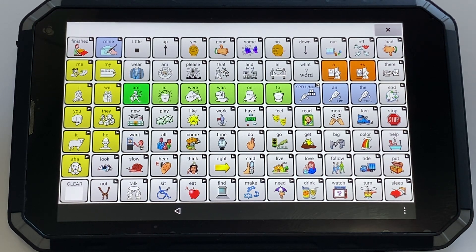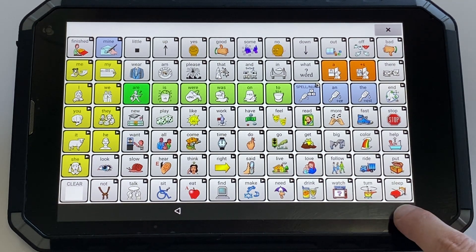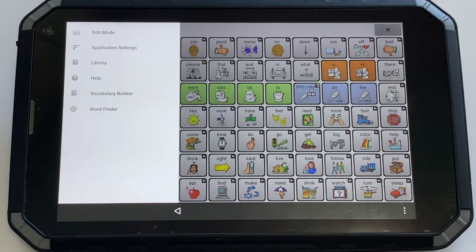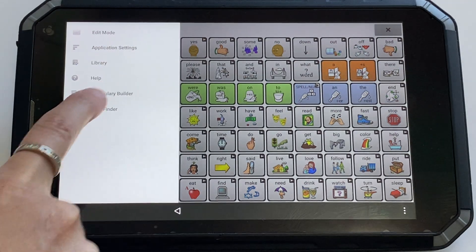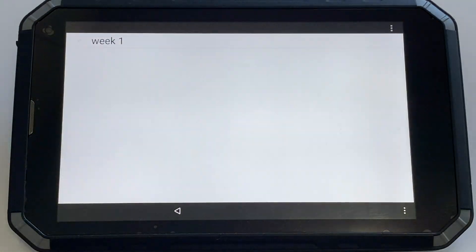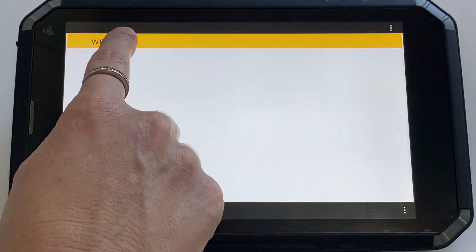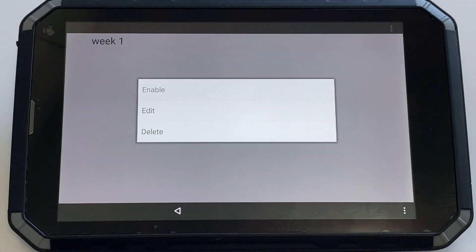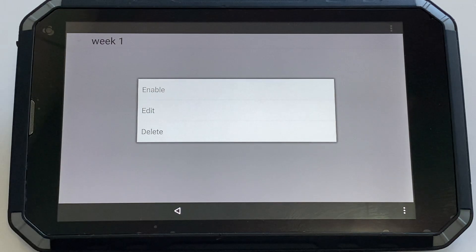If you wanted to use that list again, it's very quick. Three dots, Vocabulary Builder, click and hold, and choose enable.